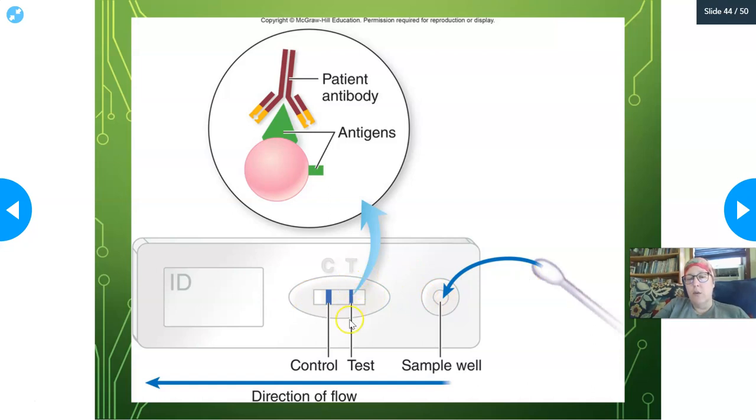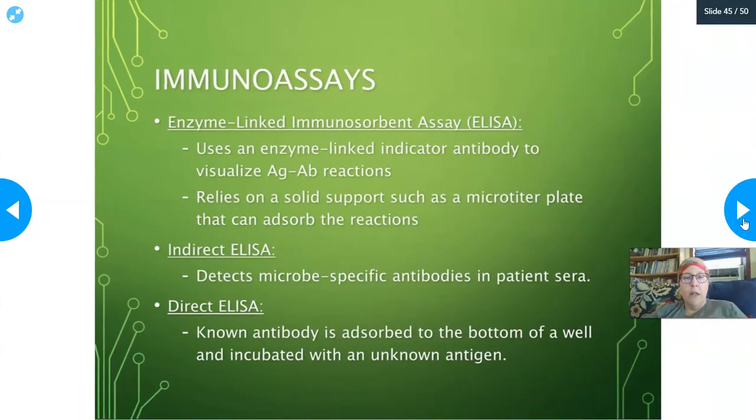So it's a line, no line. So if there's a line, it's positive. If there's no line, it's negative. That's usually how those are read.